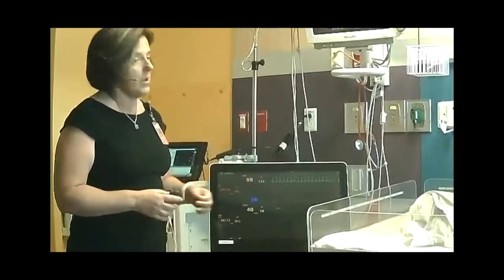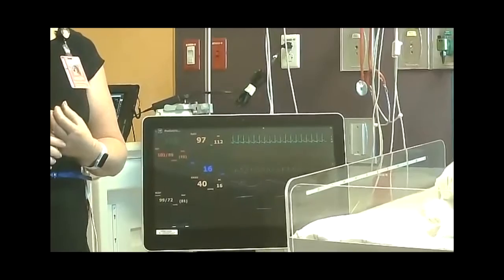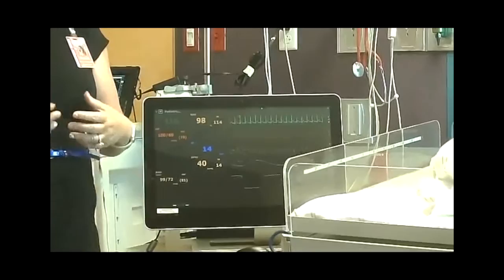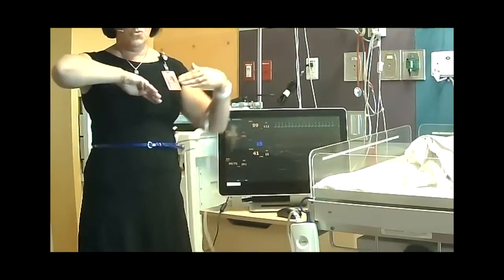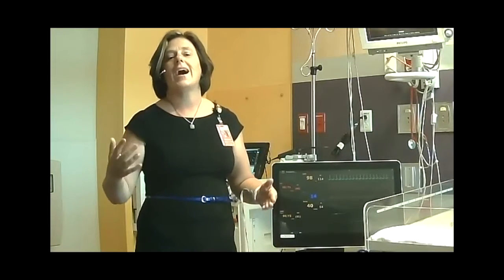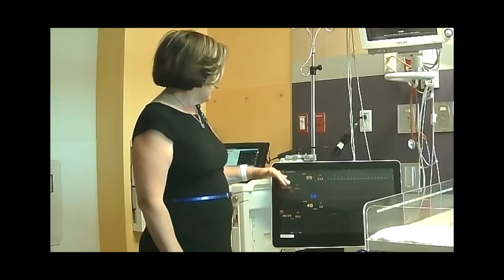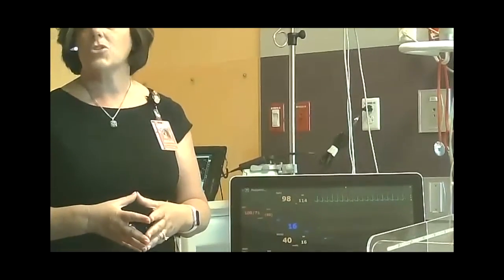There are components of the heart rhythm we also look at. There are components of the chambers of the heart, and are they firing correctly? So we're looking at it electrically through the little patches on the chest. I'm sure many of you have seen it on television and other places. Those little patches look at the heart rhythm through the heart. In different areas, on different leads, as we call them, we can actually look at the heart up this way, or we could look at the heart down this way. So sometimes you might see things turned upside down or in other ways, and it's still okay. The biggest number when you look at it is the rate, how fast. And is that a normal rate for my baby? Those are things you could ask your nurse, right?